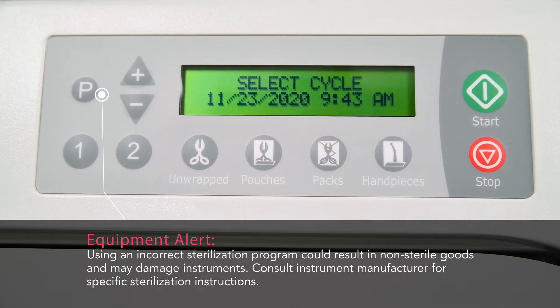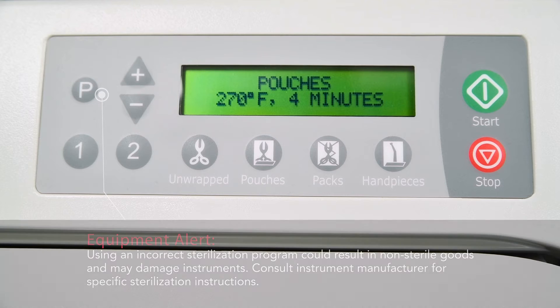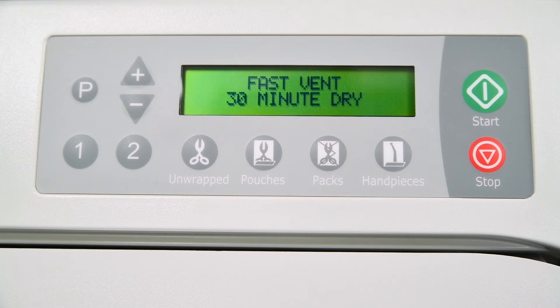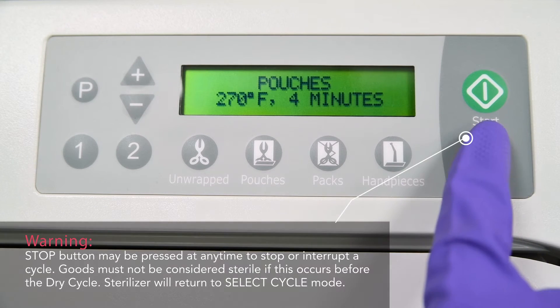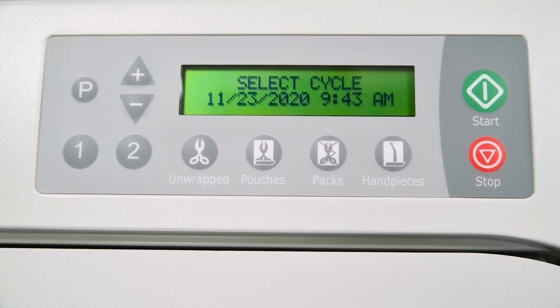Once the cycle type has been selected, two alternating messages will now be displayed. The first message shows the name of the cycle, sterilizing temperature, and the amount of sterilizing time. After a brief pause, the second message displayed will show the type of venting to be used and the amount of drying time. If the stop button is pressed before the dry cycle, indicated by the display returning to the select cycle mode, items in the sterilizer should not be considered sterile.